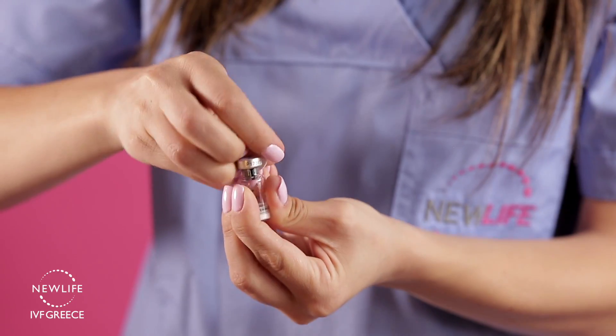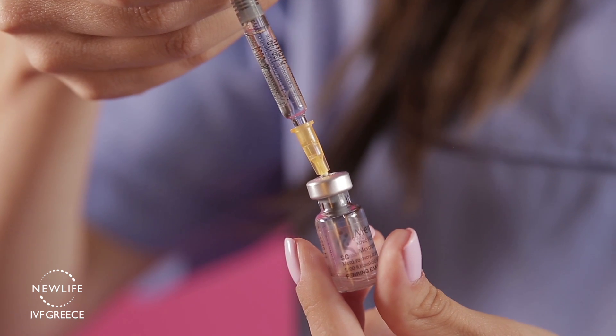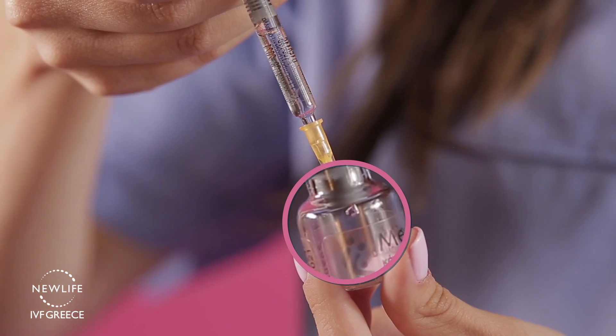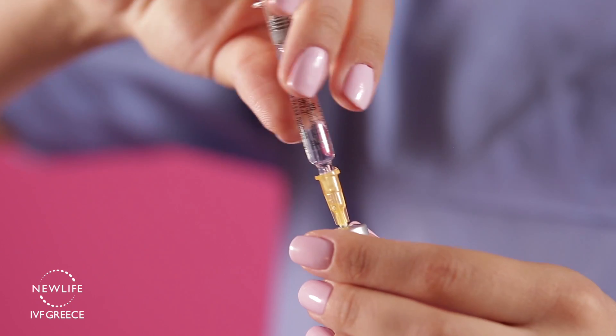Remove the protective cap from the vial of powder, insert the needle through the rubber top of the vial, and very slowly press the plunger down, adding all the solvent to the inside of the vial in a dropwise fashion. Repeat using the same needle with the second pre-filled syringe.